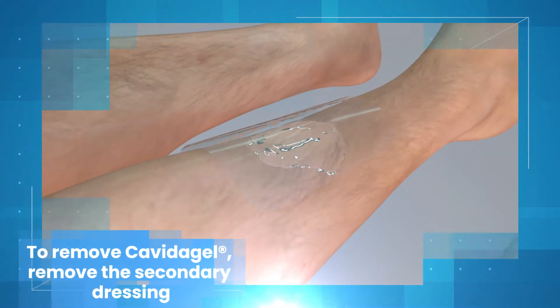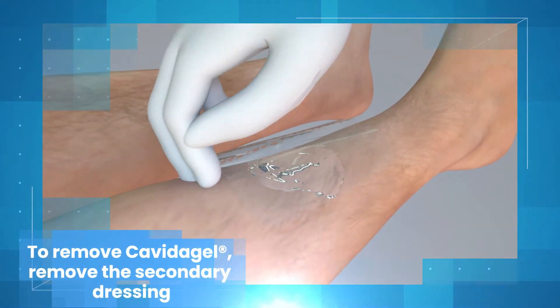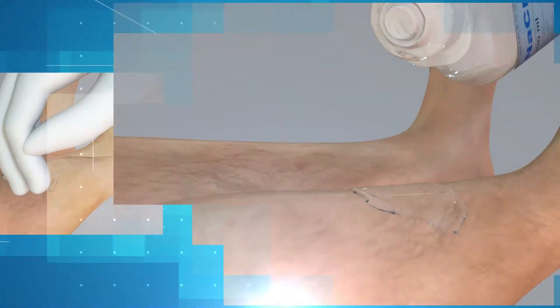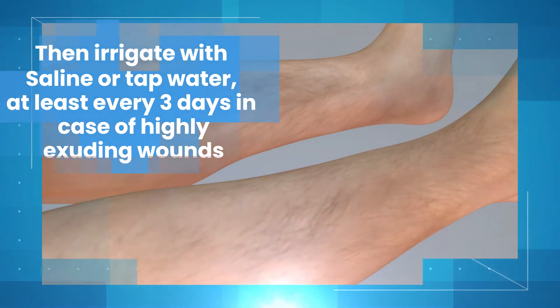To remove Kavita Gel, remove the secondary dressing. Then irrigate with saline or tap water, at least every three days in case of highly exuding wounds.